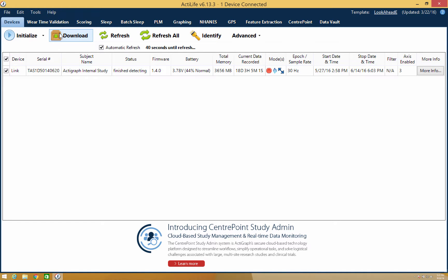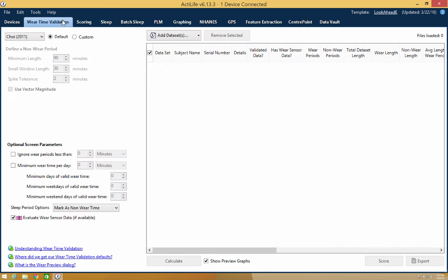Another tab in ActiLife is the Wear Time Validation tab, where you can apply algorithms to check the wear compliance of your subjects.